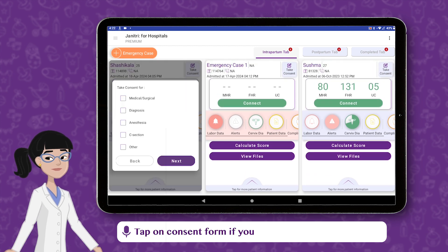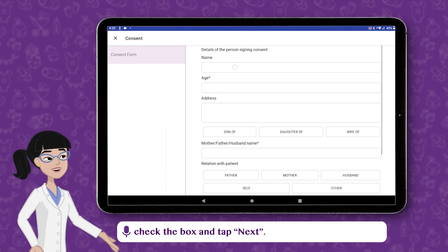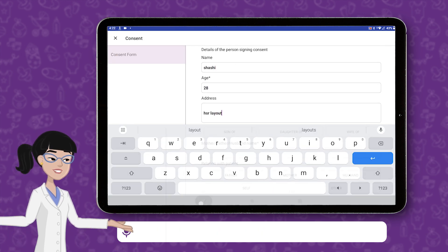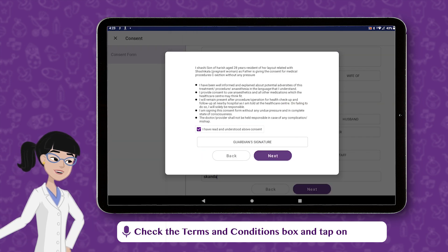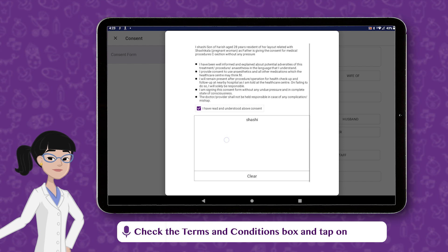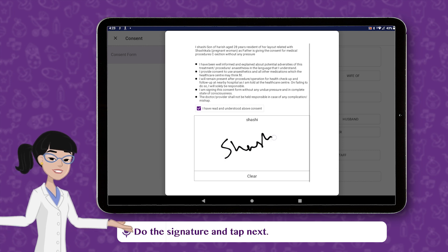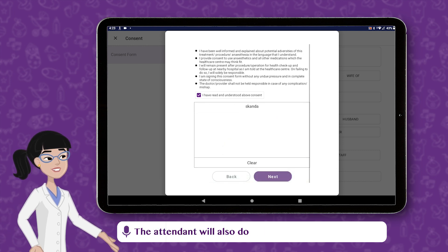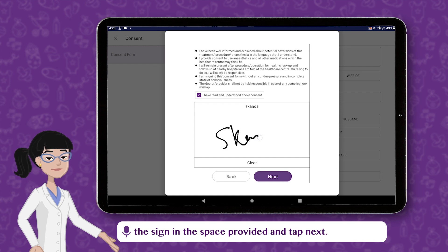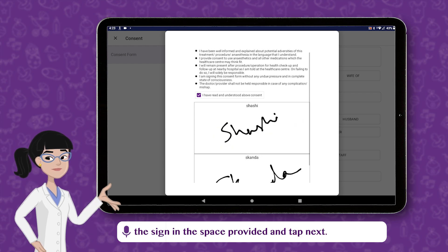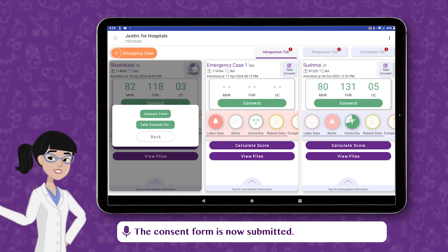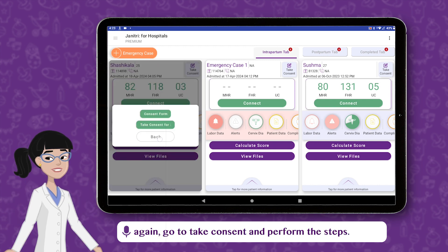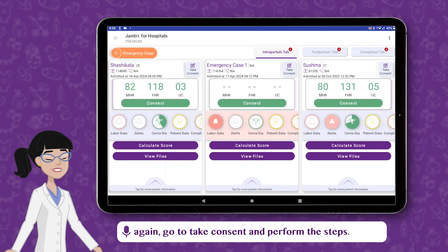Tap on Consent Form. If you need consent for any of the mentioned lists, check the box and tap Next. Fill in the details of the person who is signing the consent form. Check the Terms and Conditions box and tap on Guardian Signature. Do the signature and tap Next. The attendant will also sign in the space provided and tap Next. Check the signs and tap on Submit. The consent form is now submitted. If you need consent for something else, again go to Take Consent and perform the steps.